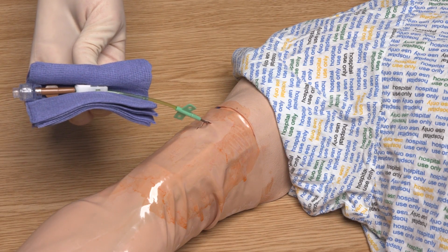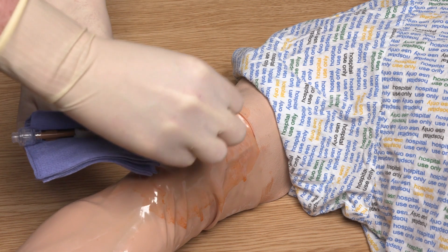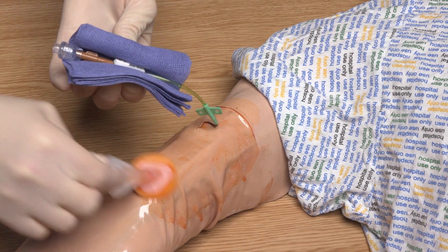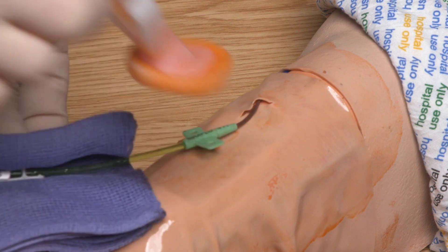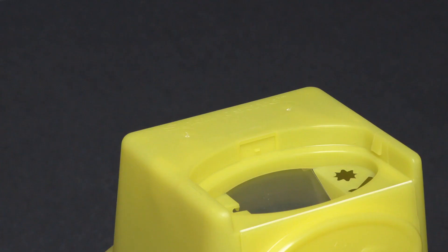I can now rearrange the equipment on the critical sterile field ready for use. I am going to hold the PICC using one of the sterile swabs. This allows me to gently support the catheter while I decontaminate the insertion site and surrounding area and reapply the securing device without contaminating my sterile gloves. I have prepared the second wand and begin to clean from the insertion site outwards to avoid recontamination of an already cleaned area. I also need to clean the wings on either side of the catheter, doing this for at least 30 seconds and then allowing the solution to dry naturally, which also takes about 30 seconds.